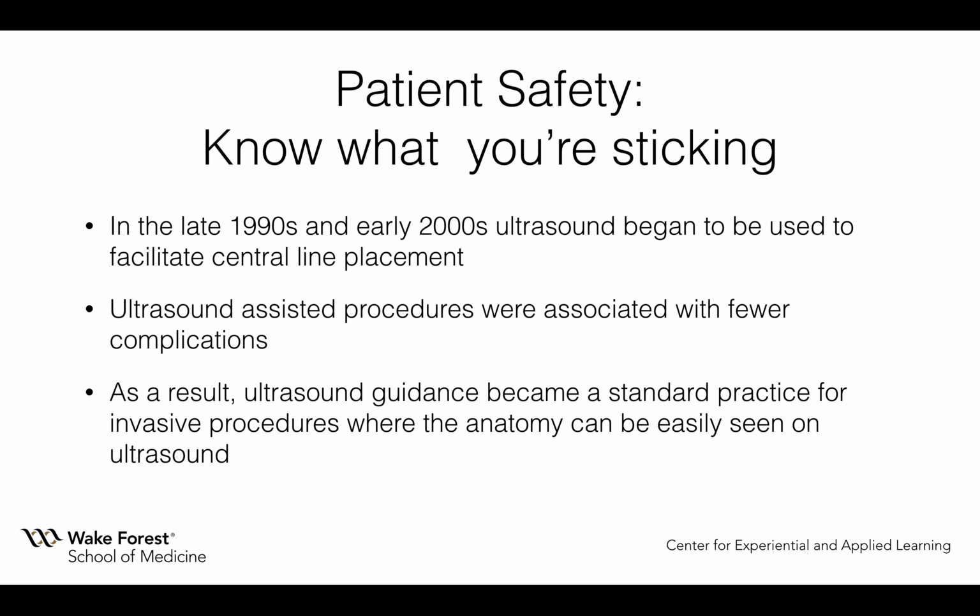The real change was in the late 90s to early 2000s when ultrasound really became commonplace for placing central lines at the bedside. And since then, bedside ultrasound has extended to help facilitate many other procedures, including paracentesis, thoracentesis, peripheral IVs, essentially all procedures for which the anatomy is easily visible on ultrasound.